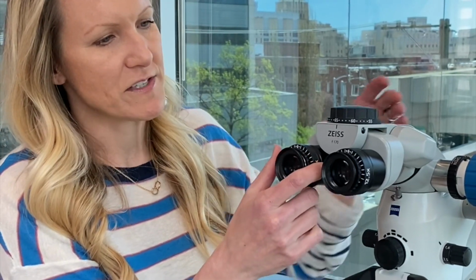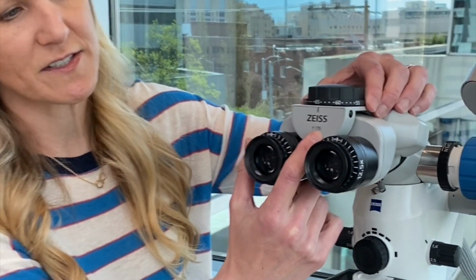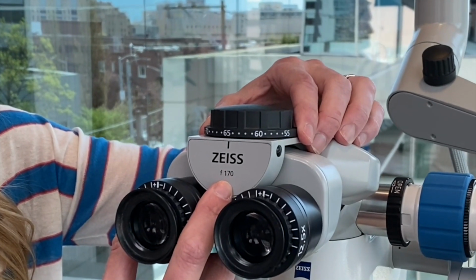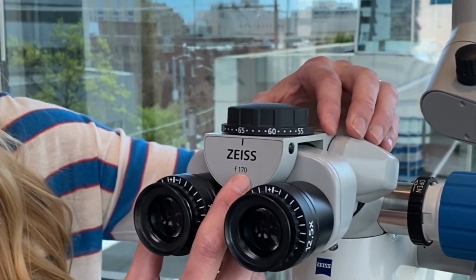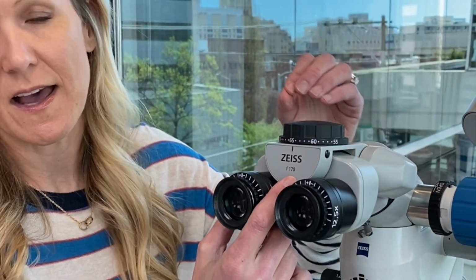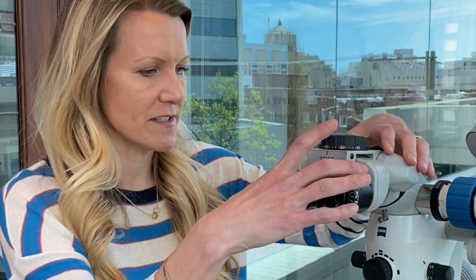The other thing about this binocular piece is you'll notice right here below this interpupillary distance knob there's a number. It says F170. I've read some information that has referred to it as an f-stop on a camera, that it tells you how much light is coming through these tubes. But really this F number is actually your lens length. So 170 is the focal length of the lens in this complex here.